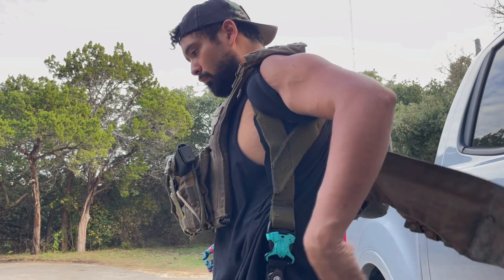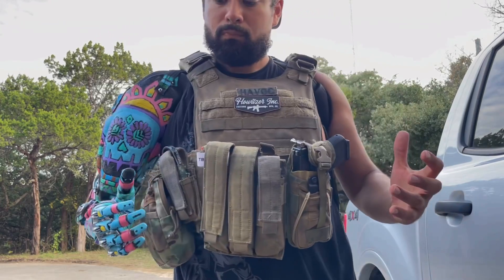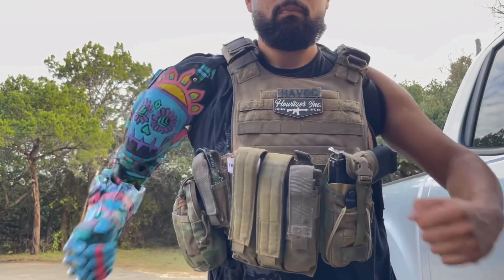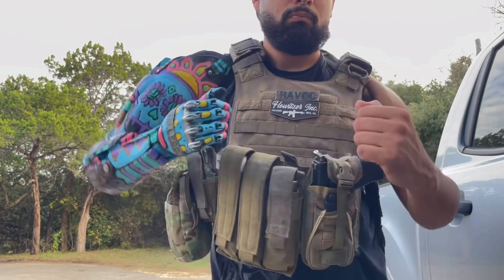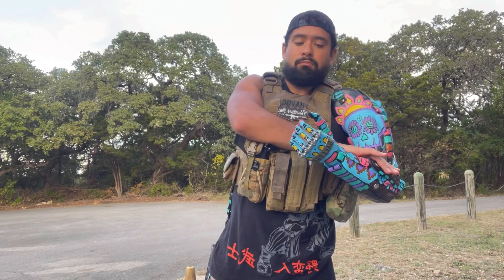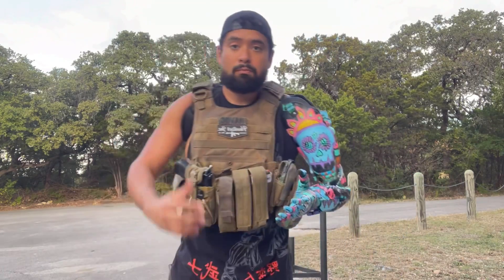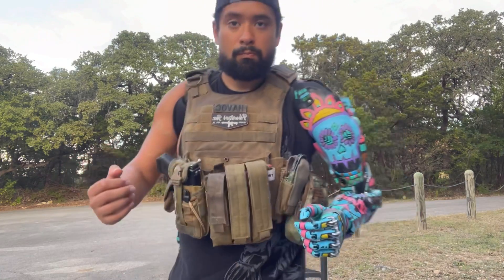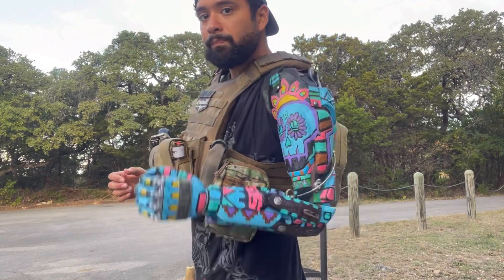I wanted to explain a little bit about what's going on with this arm, what I did to modify it, and how hard I've been working — not only to get prosthetics from the VA, but to advance them at the same time, because of a bunch of issues I've had. Again, I'm Sebastian with Lupe Gallegos, Marine veteran, and I wanted to start explaining my story and my prosthetics here on YouTube. Thank you for engaging with me.